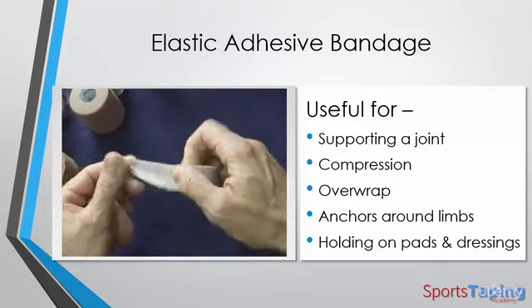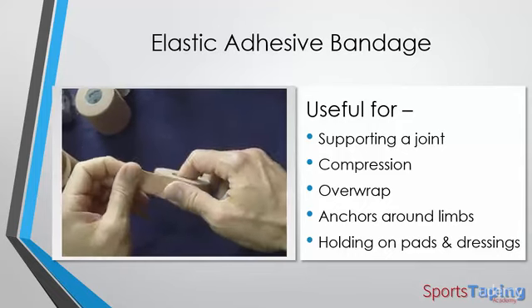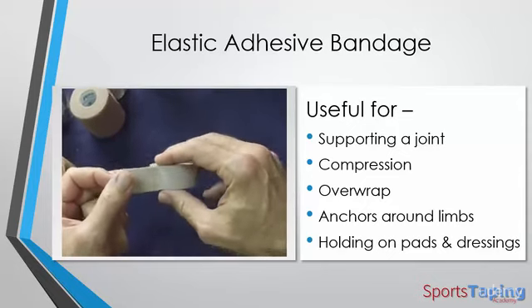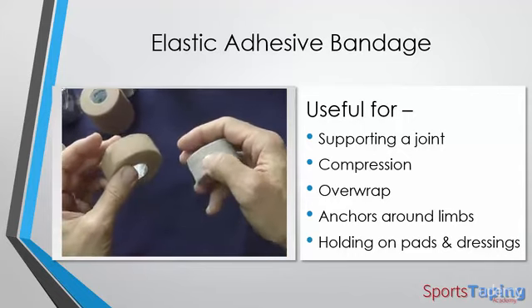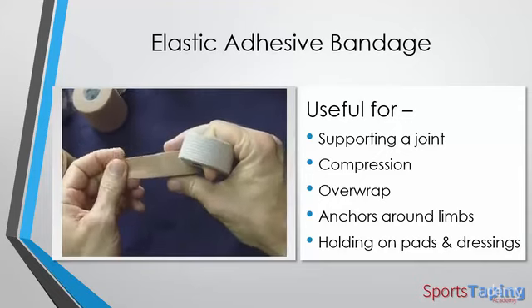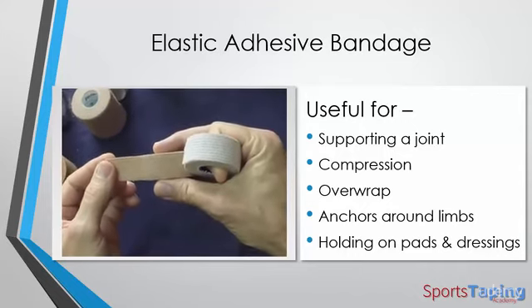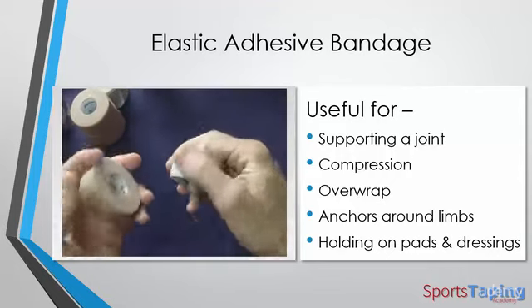But as you can see, there's a lot of variation in the amount of stretch. So for example, if I was going to use a 25mm EAB tape to tape a thumb, which we will demonstrate in a future video in this course, I would prefer to use a bandage that has less stretch and more support. So we're going to be able to restrict the movement of the thumb and at the same time support it. So once again, tape selection is important.